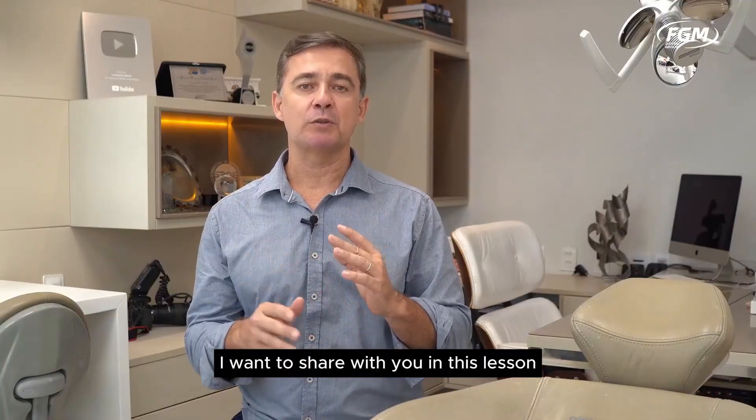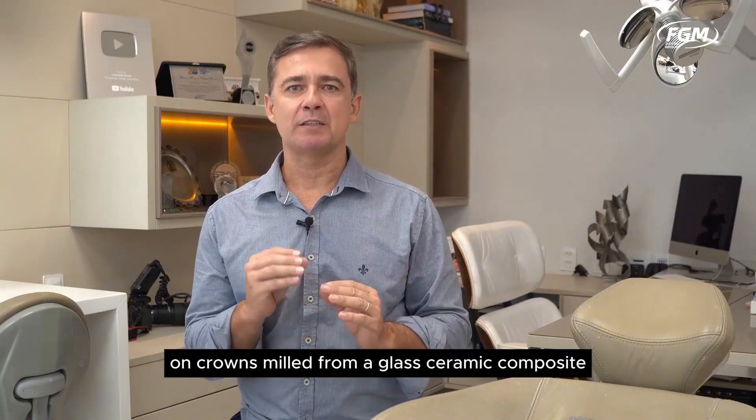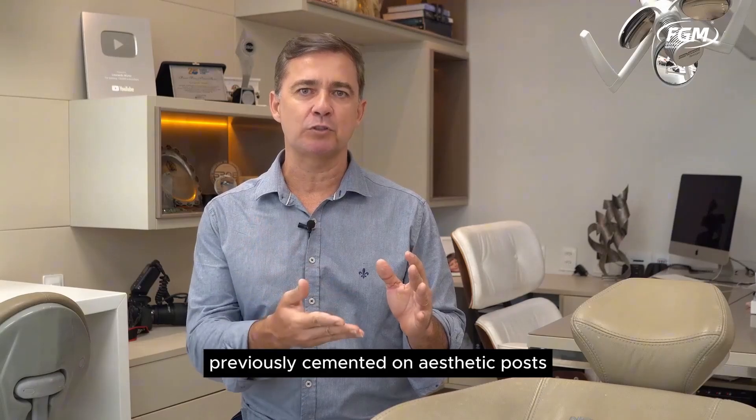I want to share with you in this lesson the step-by-step technique of composite resin veneers on crowns milled from a glass ceramic composite — in this case Brava block by FGM — previously cemented on aesthetic posts and cores.